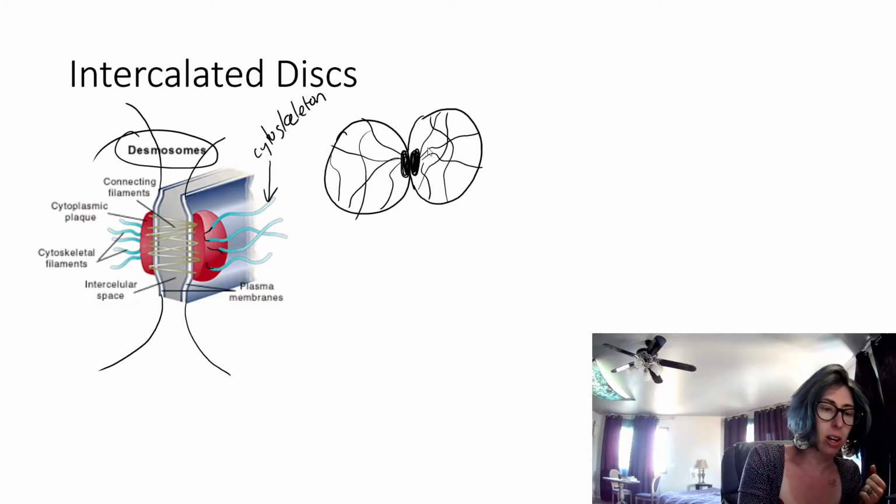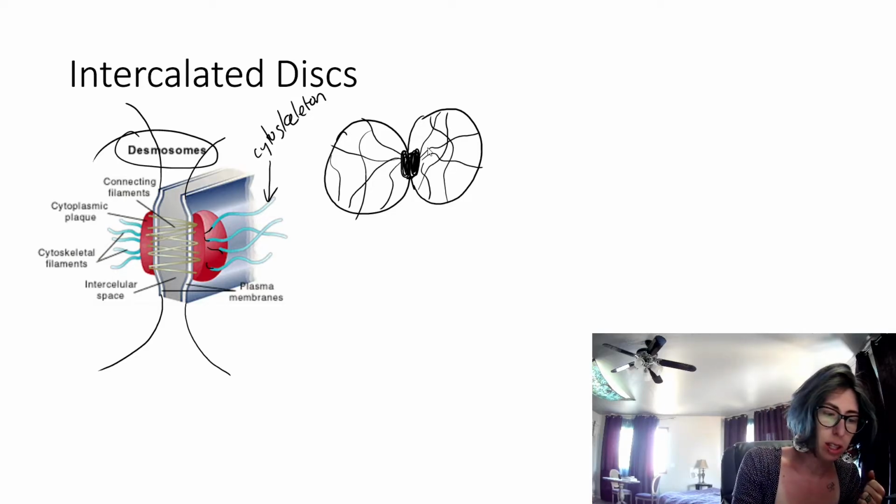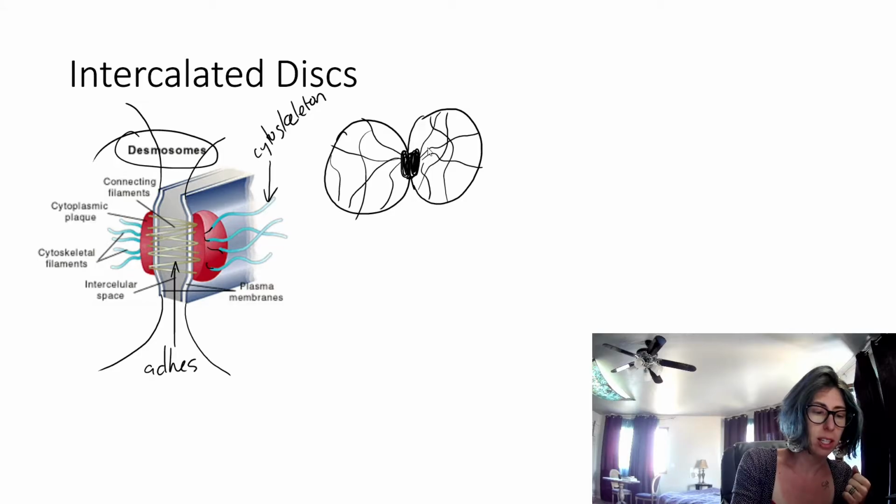And then on the other side, there's these proteins, these adhesion proteins between them. Let's see, they're called connecting filaments here, but you could call them adhesion proteins.